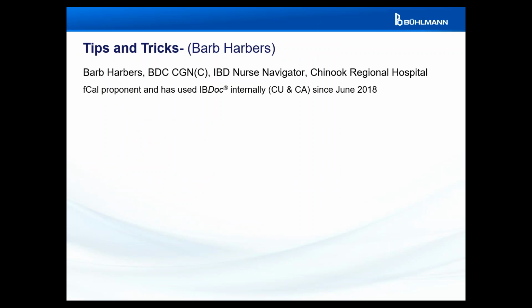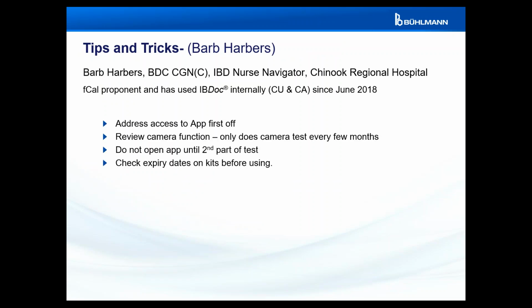So with that in mind, I'll bring up the next slide, which is to introduce Barb Harbers, who is an IBD nurse navigator in Lethbridge out of Chinook Regional Hospital. She is a clinical user and a clinical administrator for her portal. She's very much a Calprotectin proponent, has used Calprotectin or IBDoc internally since June of 2018 when we set up her portal. Prior to that, she was also involved in the initial IBDoc first Canada study out of Alberta and was an external site running IBDoc.